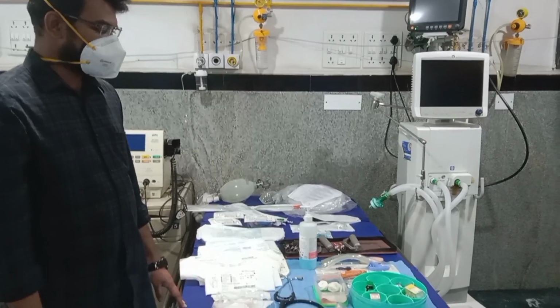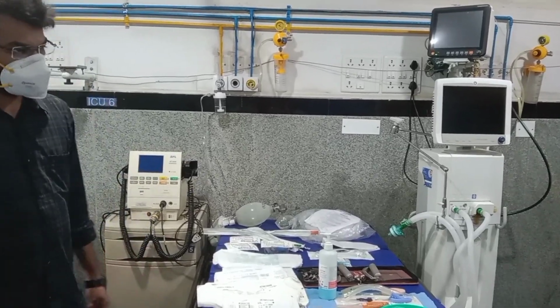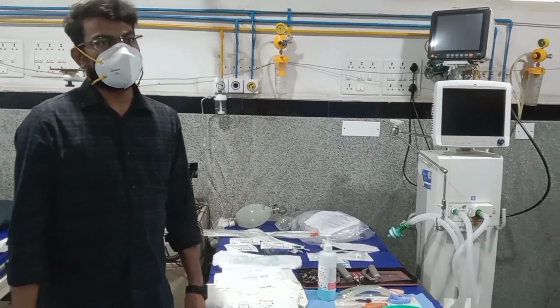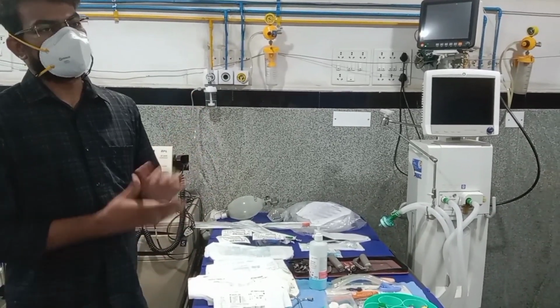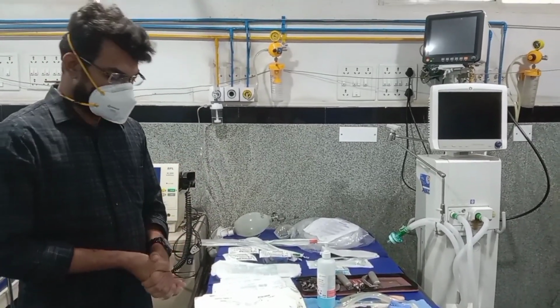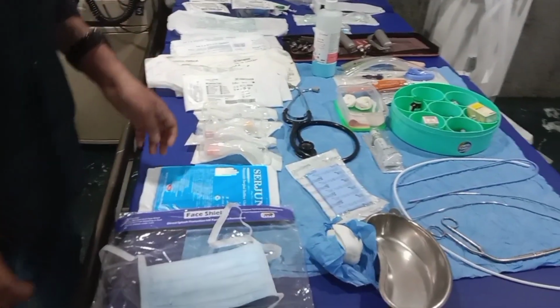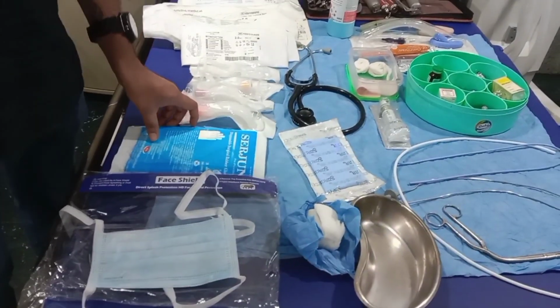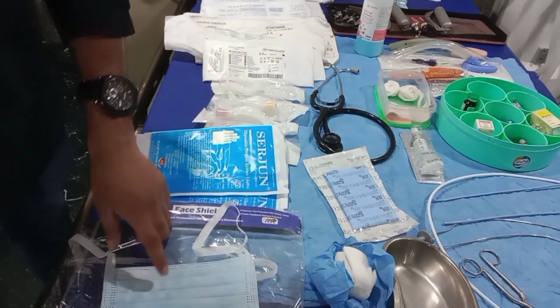Today we are discussing the intubation procedure. So prior to intubation, we should make sure that we are in aseptic condition. We should wash our hands, be prepared, and then put on a gown, and then we should use surgical gloves, a face shield and a face mask.